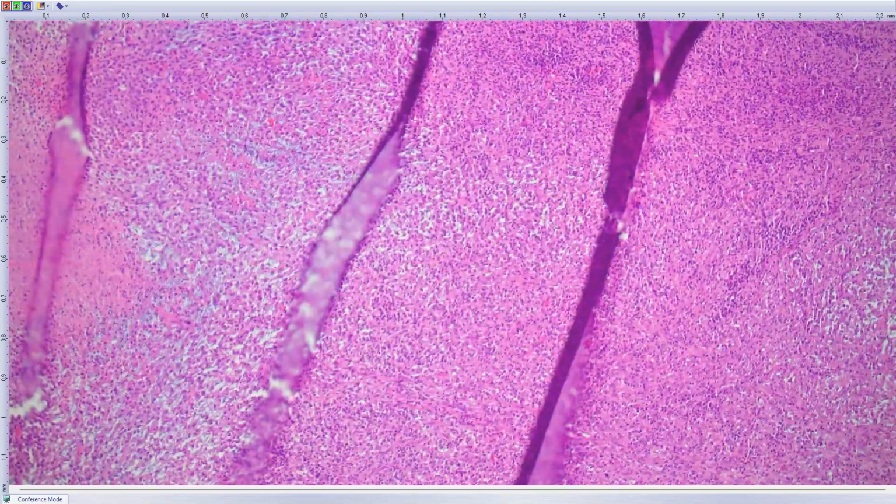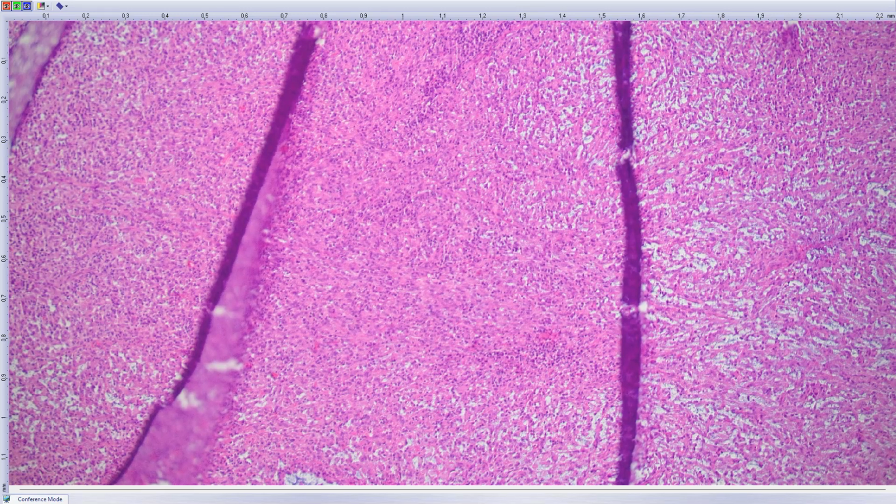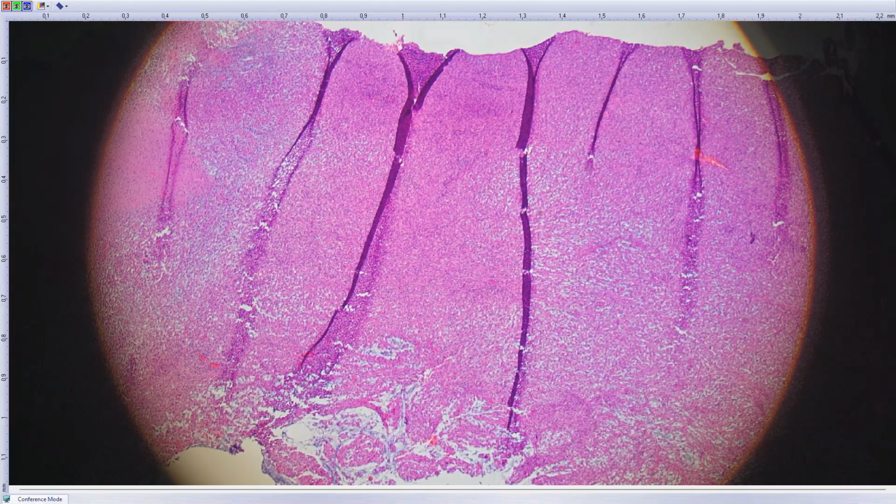So what I do in this situation, I do the basic immunohistochemical panel where we have some cytokeratins, which were completely negative, some melanocytic markers S100, SOX10, HMB45. I do EMA as another carcinoma or epithelial marker, and also a marker of perineurial cells, which in this case, I mean, it's not likely to be perineurial, but it's good to have it there. Definitely desmin, and whenever I consider rhabdomyosarcoma as a potential diagnosis, I also add MyoD1. So I also did MyoD1 here, was also negative.